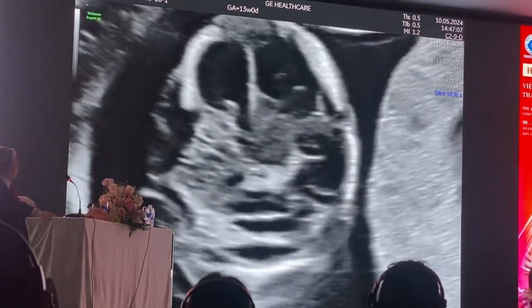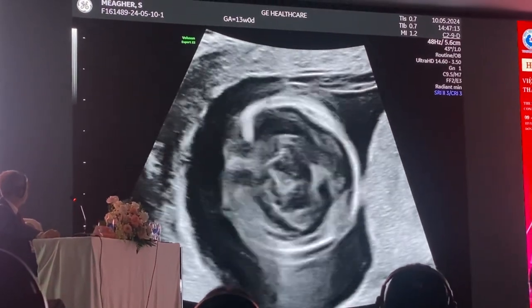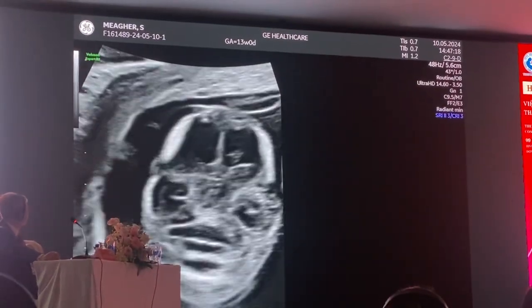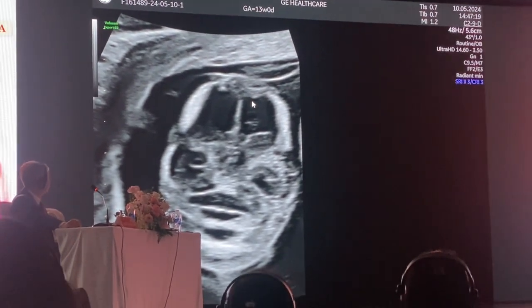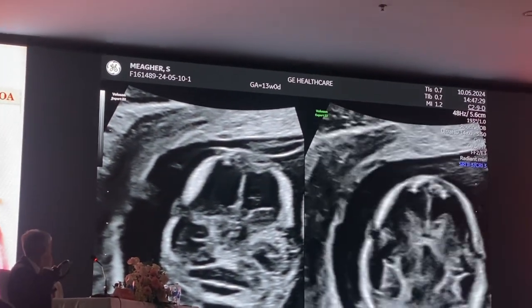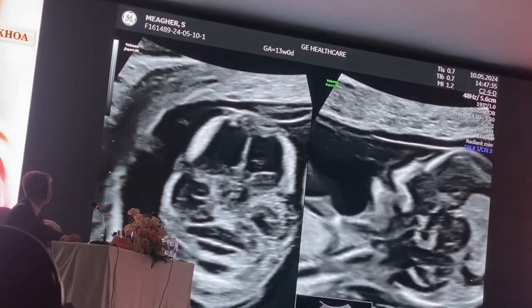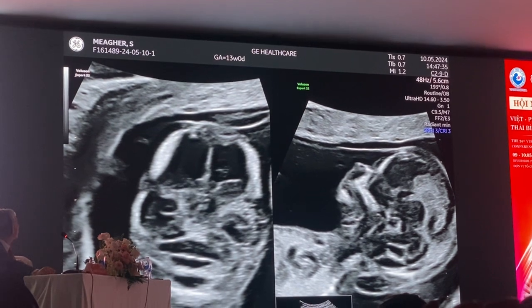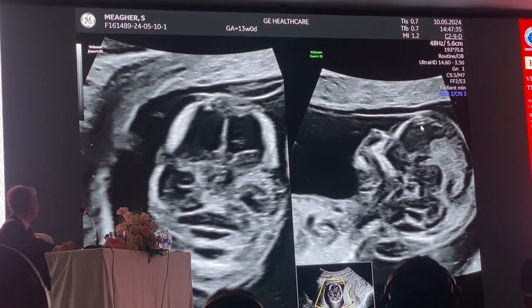In this view, the reason why those measurements are important, of seeing these two echogenic lines, is this is how to get a perfect nuchal translucency. I'll split the image, so you see the two lines of the anterior horns, and when the baby's in that position, you then simply rotate your transducer 90 degrees. So now I can see them, and then I rotate 90 degrees, and this is a very reproducible way of how to get a nuchal translucency measurement. So if I come back there, this is the border of the anterior horn, and this is the point here that I rotate the probe.